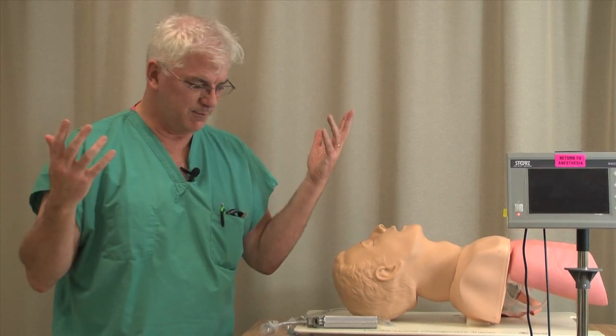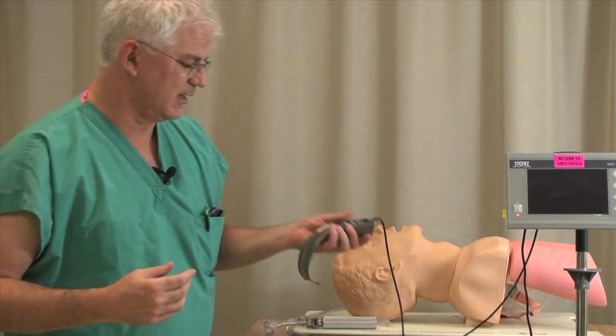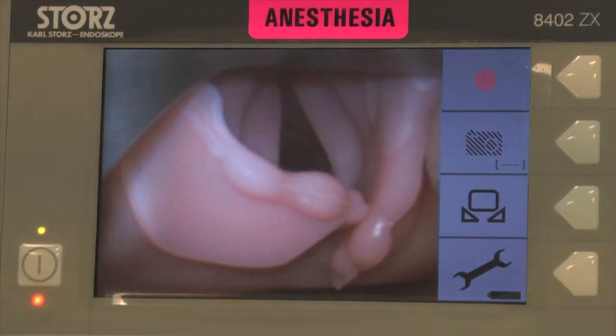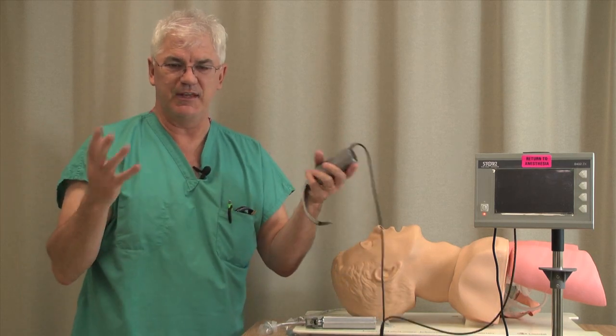GlideScope is just one of many names, but it all boils down to the same thing. This is actually a Storz thing. It all boils down to a device which has a screen on which you can see what's going on. Whether it's a GlideScope or Storz, they all kind of have the basic idea.